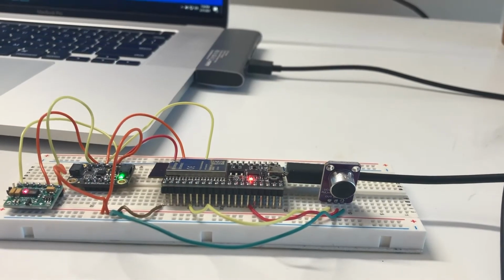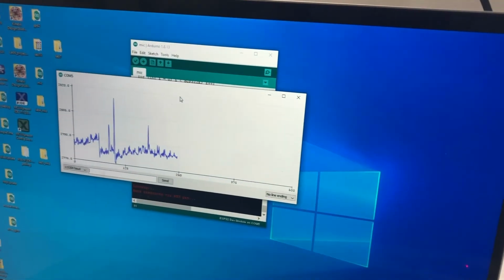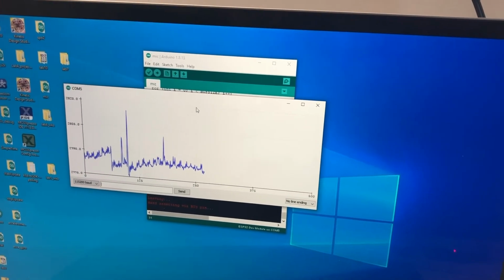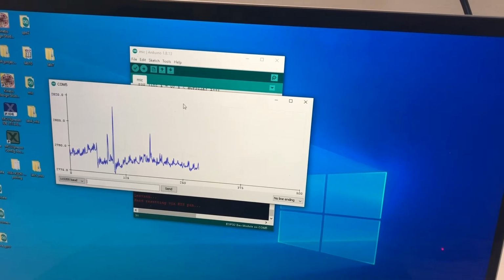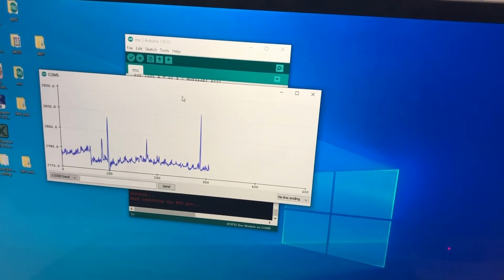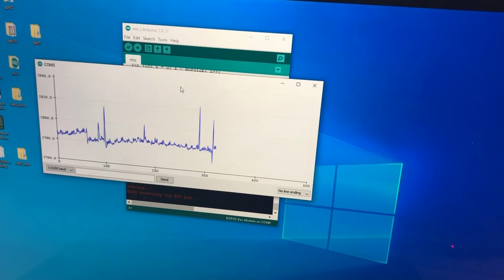Lastly, we have our microphone. I've already loaded the code from the Arduino IDE to the ESP32, and I've got the serial plotter running. It's been sitting for some time, so that's just some low-level noise, like the clock ticking and stuff in my room. And so if I bang the table, you'll see that spike. And then for testing purposes, I'll play a snoring sound effect, and we will observe the spike going up and down.